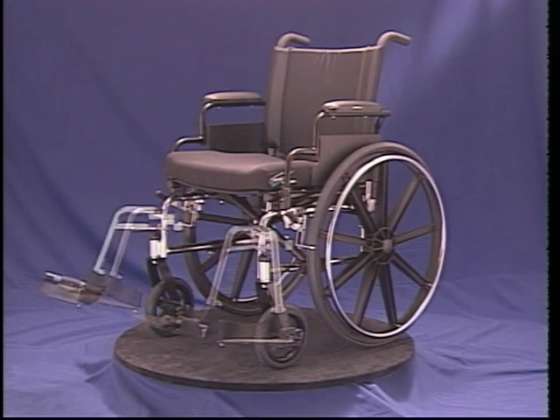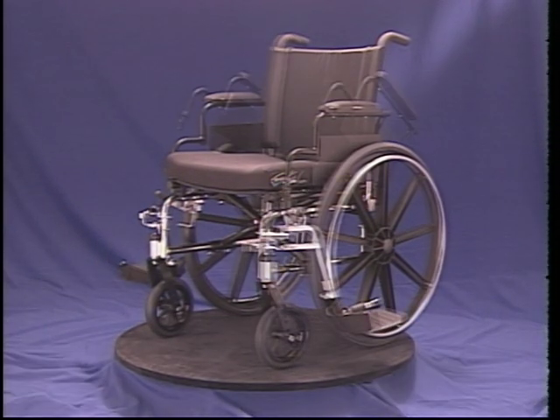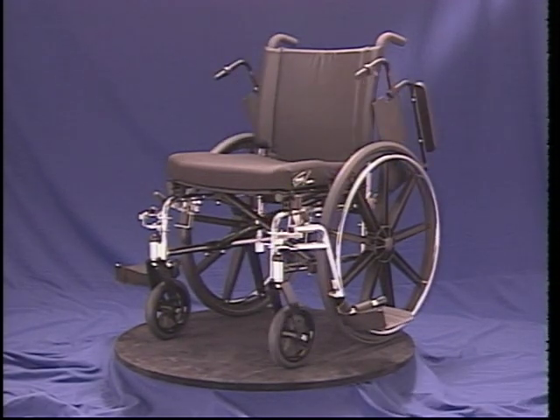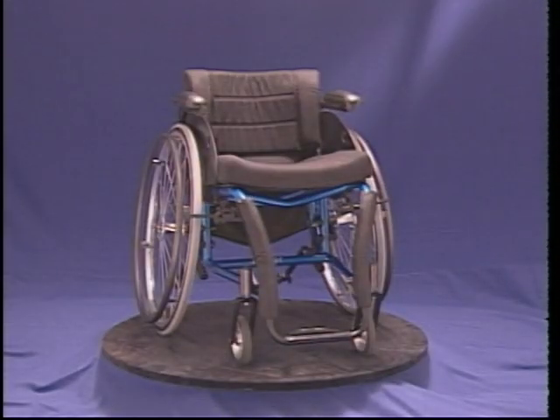Chair length is influenced by footrest type and angle. There are footrests that can detach or swing away to allow for greater maneuverability. With some chairs, you can also adjust the center of gravity to increase maneuverability.